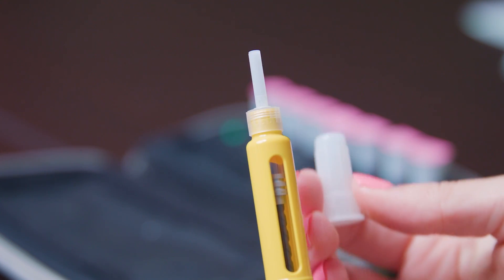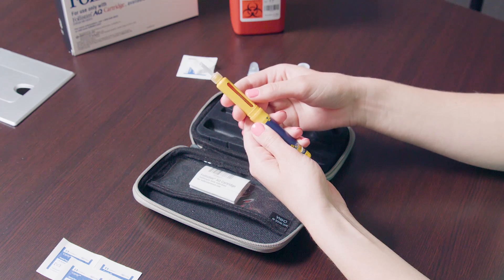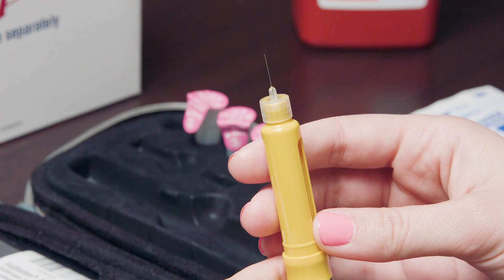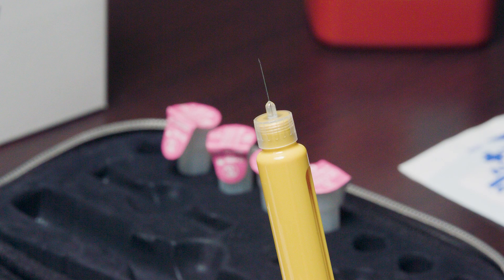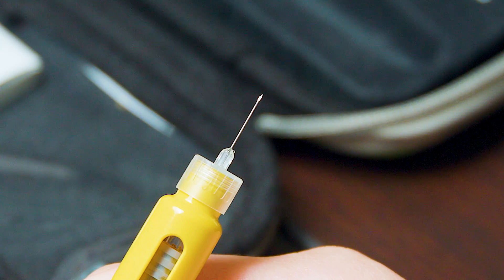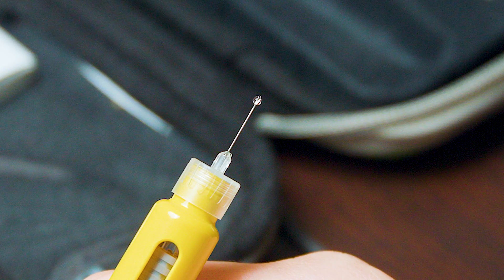There is an outer and inner cap covering the needle. Carefully remove the outer cap followed by the inner cap, but keep the outer cap as you will use it later for disposal of the needle. Invert the pen and hold it upright. Gently tap the side of the pen to bring any air bubbles to the top. Look to see if a droplet is formed at the tip of the needle. If you do not see a droplet on the tip of the needle, dial the dosage knob until you hear one click. Press on the administration button until you see a drop at the tip of the needle. If needed, repeat this process until a drop is formed in order to administer the correct amount of the medicine.